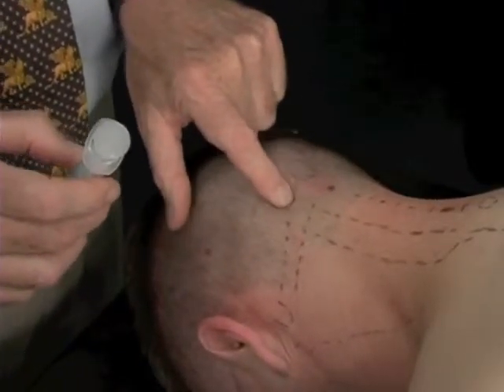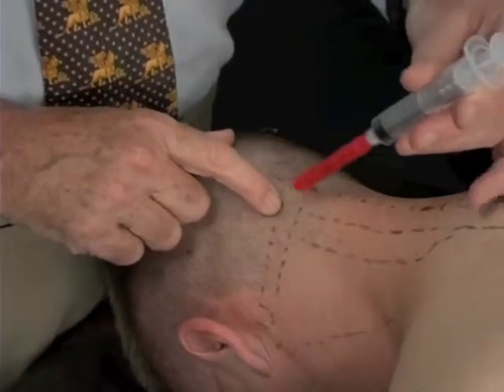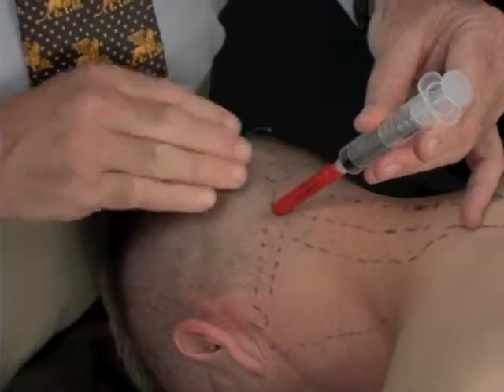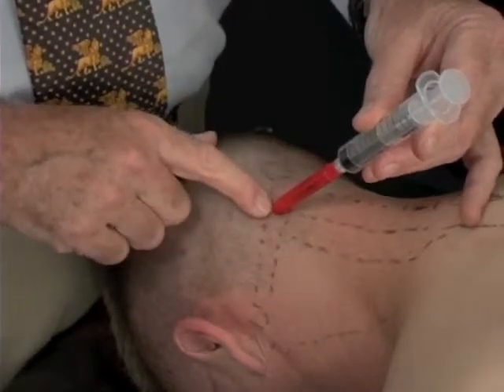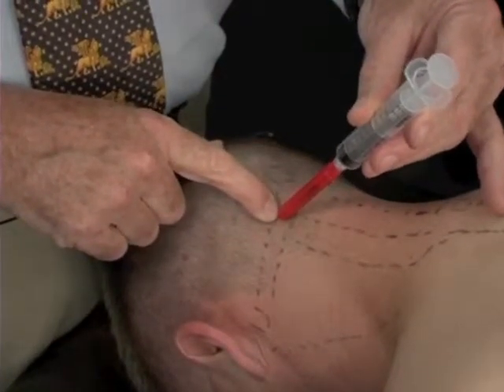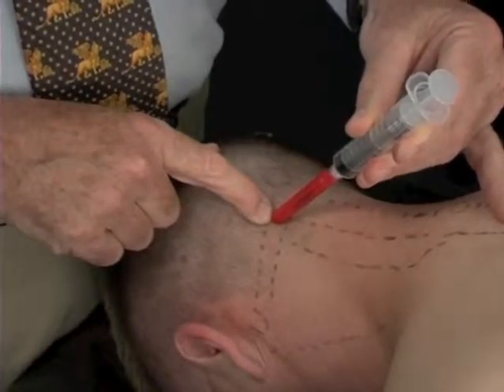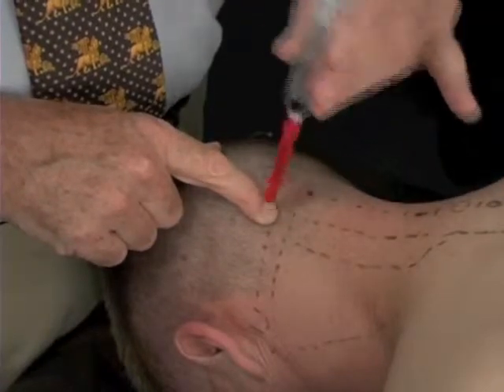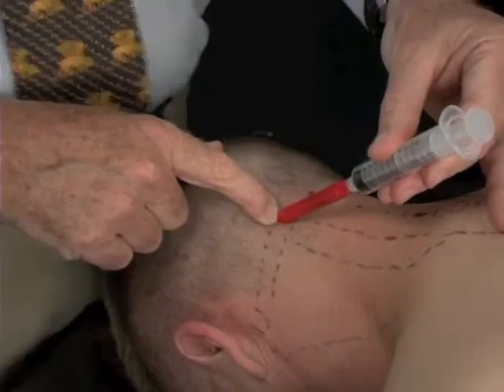We find the nuchal ridge again, keeping our finger on the skin palpating the anatomy. I can feel the curve of his nuchal ridge right in that spot. Then I come with my needle at about a 30 to 45 degree angle so that I'm perpendicular to the bone. All injections should be perpendicular to the bone. I keep my finger on the nuchal ridge so I know where I'm at, then enter with the needle directly down onto the bone. This is a very shallow injection.